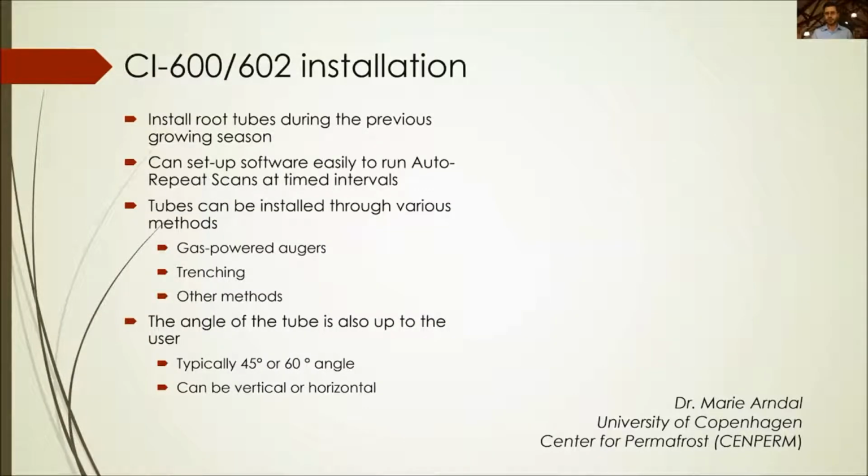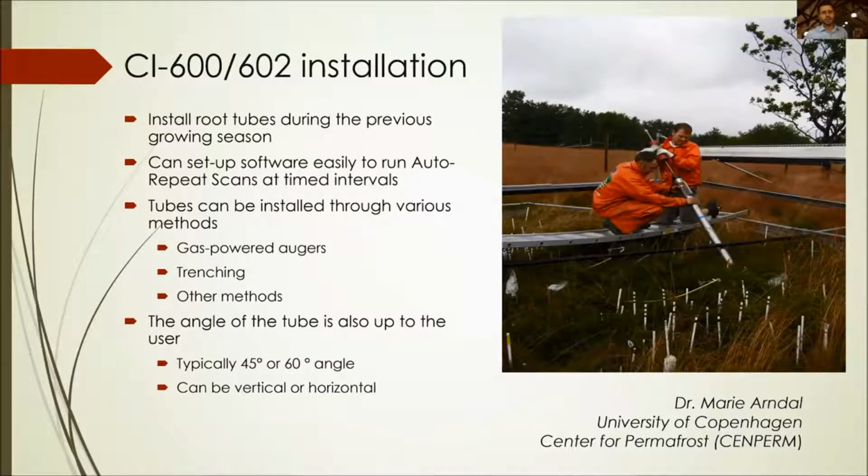Now I'm going to cover the CI-600 and CI-602 installation and some of the methods of putting these tubes in the ground, mostly because that's most of the questions I end up getting right before going to RootSnap.